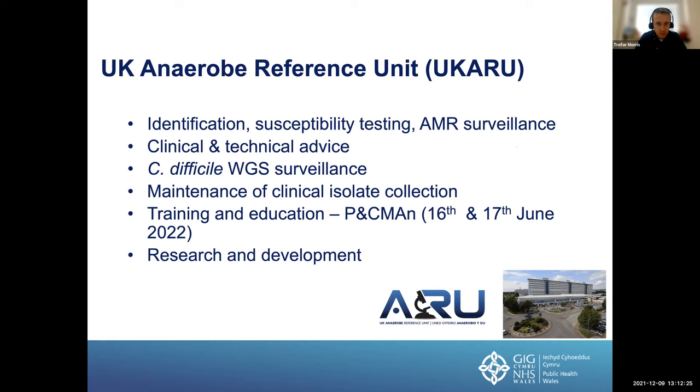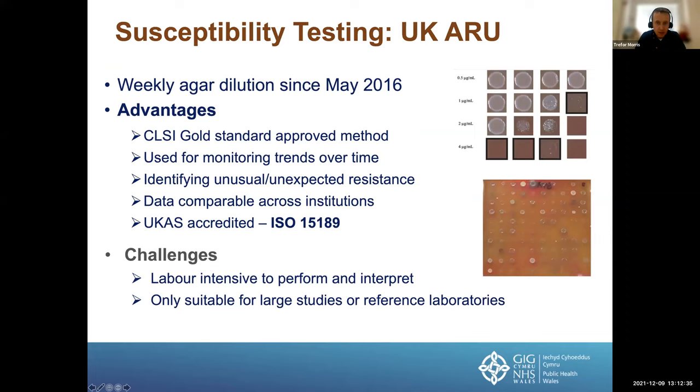And we do a lot of R&D as well. Next slide, please. So our methods in terms of agar dilution, we've been running this now since 2016. And I think that probably is around, well, over 200 times we run this now on a weekly basis.